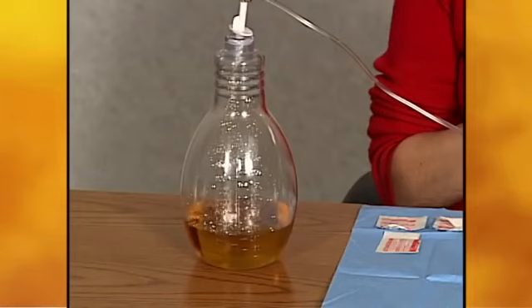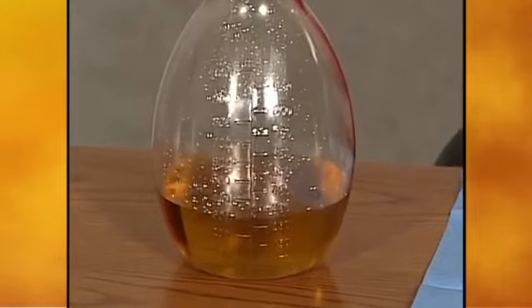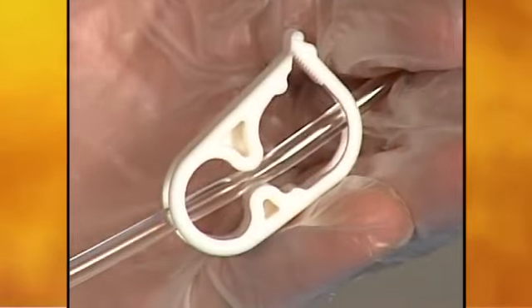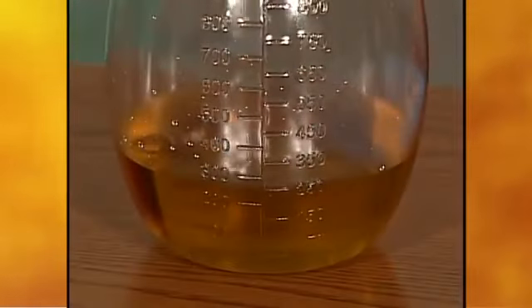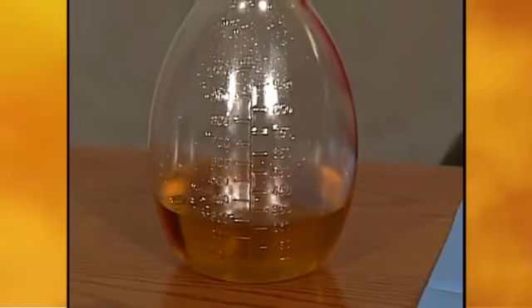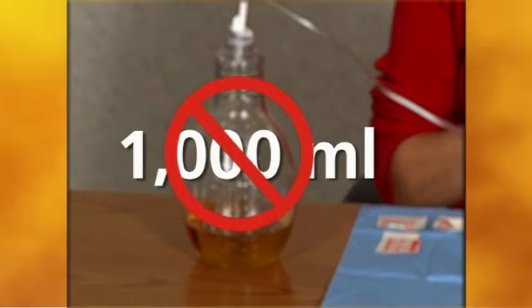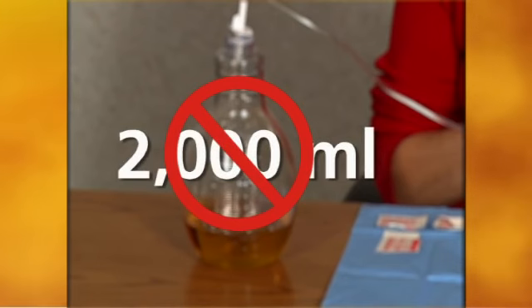Drainage may be completed if the patient is not too uncomfortable. It usually takes only 5 to 15 minutes to complete the drainage. The flow will probably slow when drainage is almost finished. When the flow stops or when the bottle is filled, squeeze the white clamp on the drainage line closed. If a second bottle is needed, disconnect the first bottle and follow the instructions for connecting a new bottle. The catheter tip does not need to be cleaned between bottles. Do not drain more than 1,000 milliliters from the chest or more than 2,000 milliliters from the abdomen at any one time.